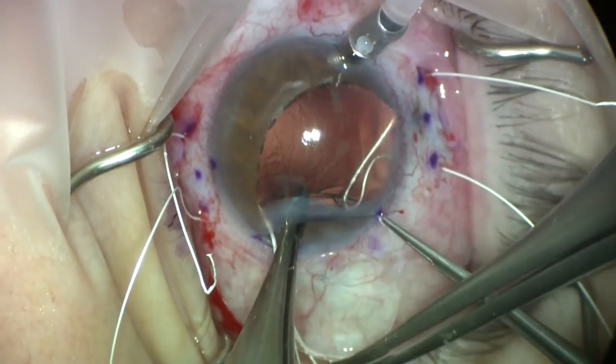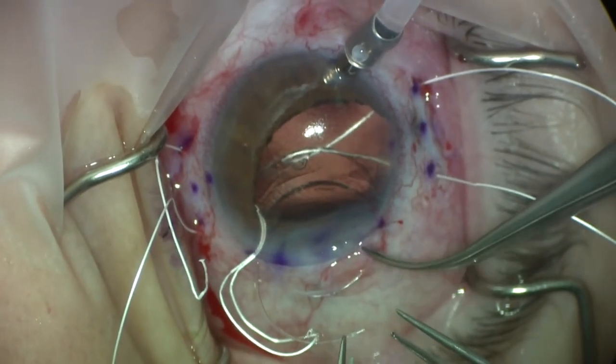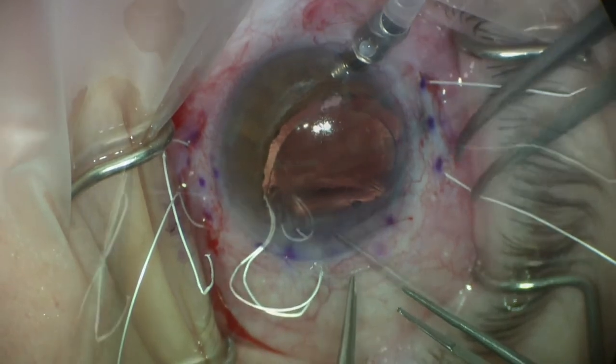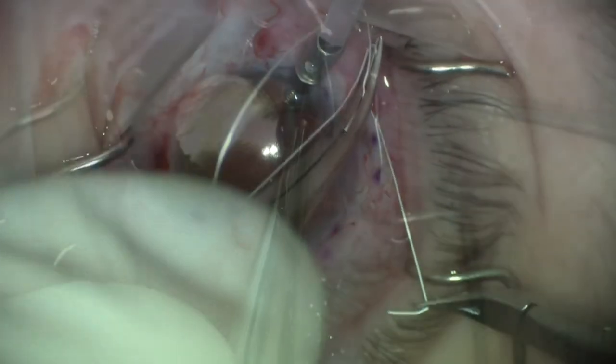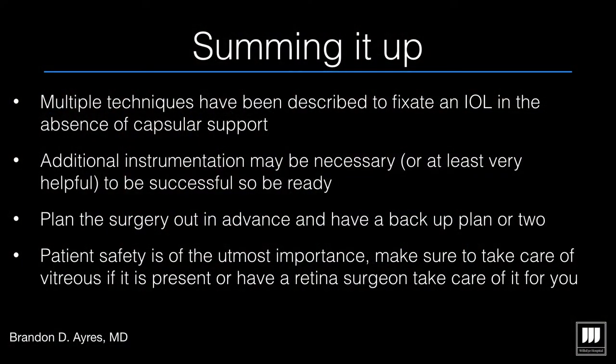With the sutures laced, we carefully tuck the IOL into the posterior segment, being careful not to tangle the sutures. The nice thing about these larger implants is you can simply pull the haptic to the scleral wall and tie your suture — you do not have to balance suture tension the way you do with foldable IOLs.